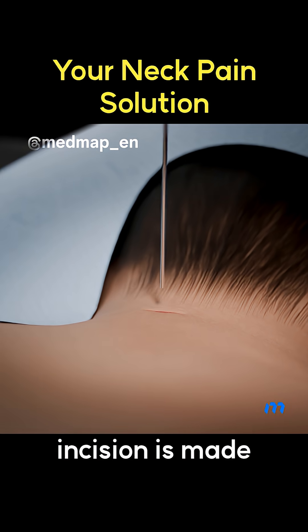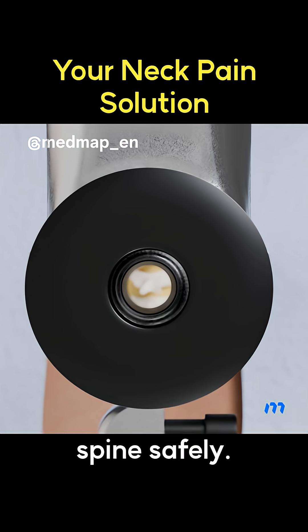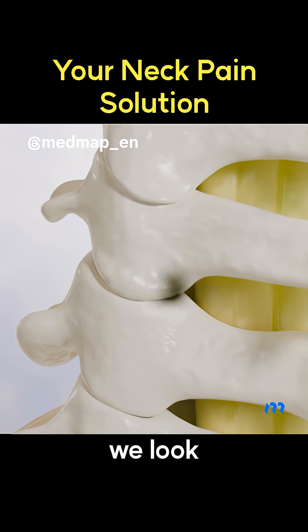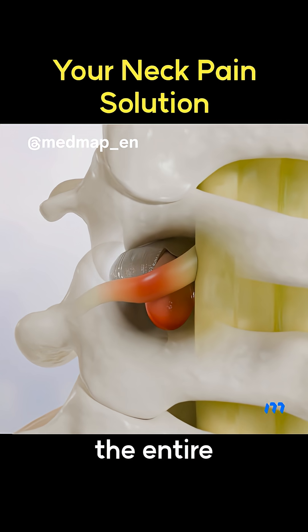A tiny 1 cm incision is made, and an endoscope is inserted to reach the spine safely. The first thing we look for is the V-point, a reliable landmark that guides the entire surgery.